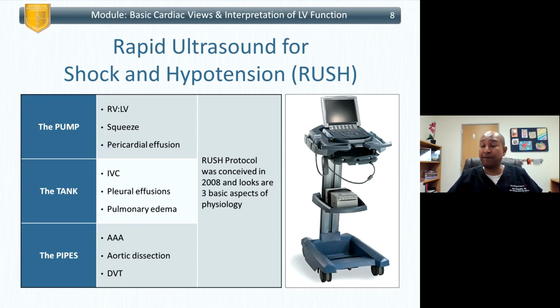Of course the pump refers to the heart. How is the left ventricle doing? How is the right ventricle doing? Is it contracting? Is it squeezing? Is there a pericardial effusion, thinking about some kind of obstructive shock?